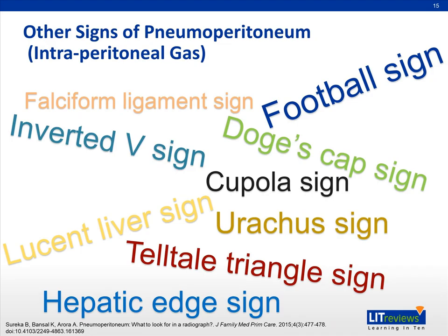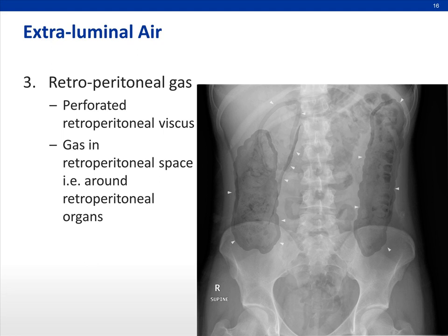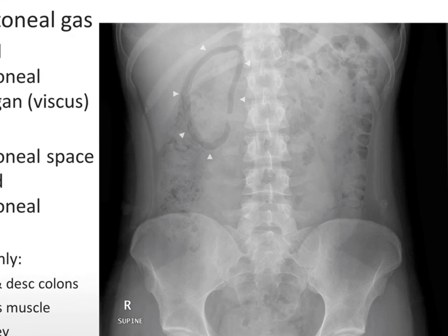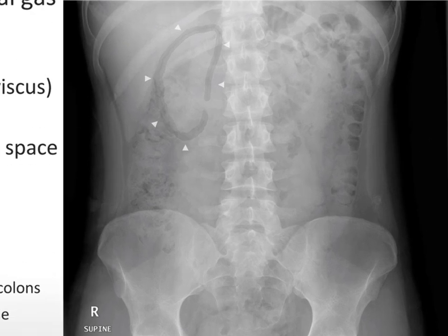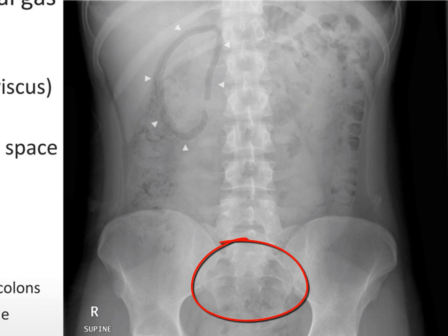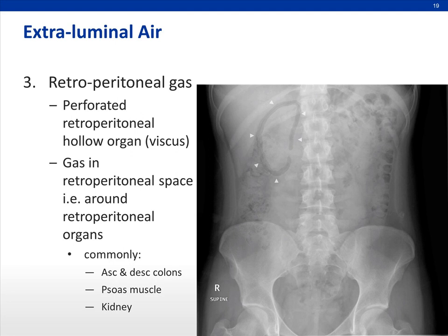There are many signs of pneumoperitoneum — at least 10 of them. Retroperitoneal gas is gas in the retroperitoneal space. You want to look for gas around retroperitoneal organs such as the ascending and descending colons, the psoas muscles, and around the kidneys. It is usually due to perforation of a retroperitoneal hollow organ — the ascending and descending colon, the second to fourth part of the duodenum, and the proximal rectum. However, it doesn't always mean perforation, because any pathology in the retroperitoneum that can produce gas, such as infection, can also result in retroperitoneal gas.